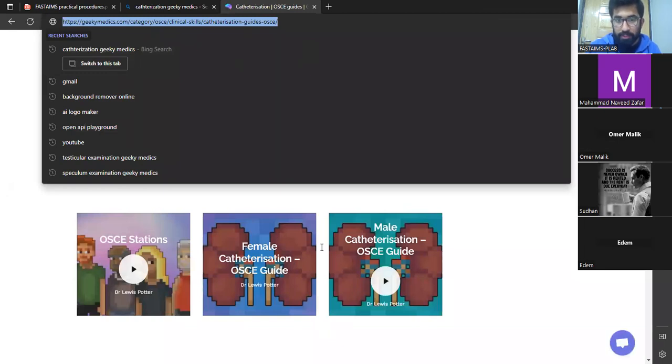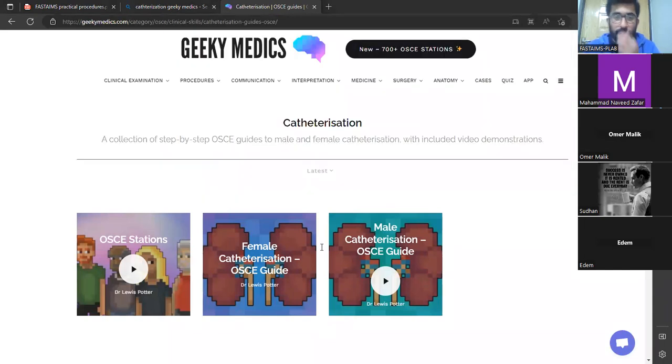I am posting this in the comment section. Just watch this video and just let me know. And remember a few things, how they are following the steps. Cleaning, important thing. Draping, that's another important thing. And then how they are passing catheter without touching the catheter, from over the wrapper. And then how they are going to attach the bag. Just watch it.